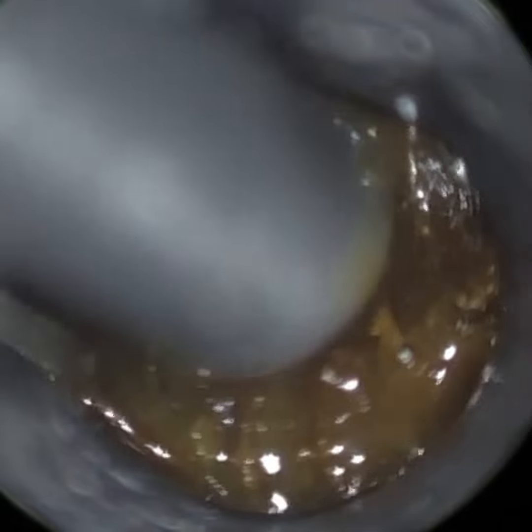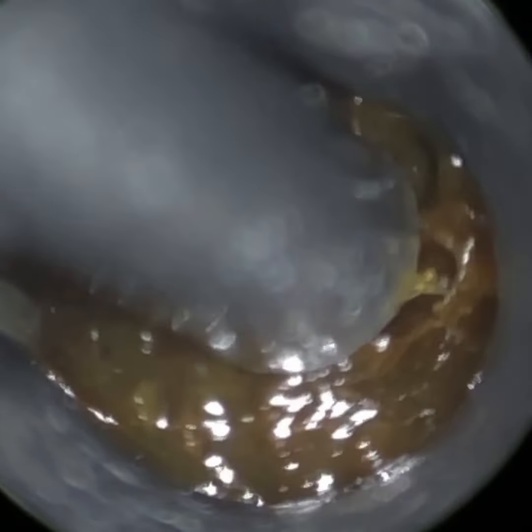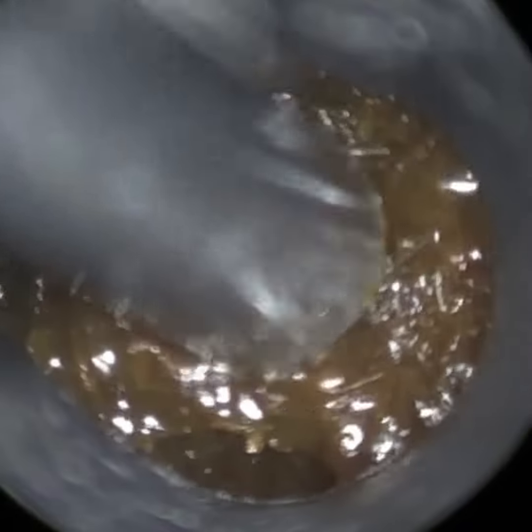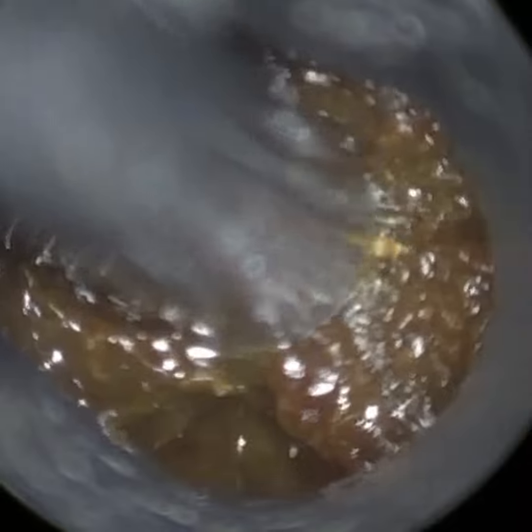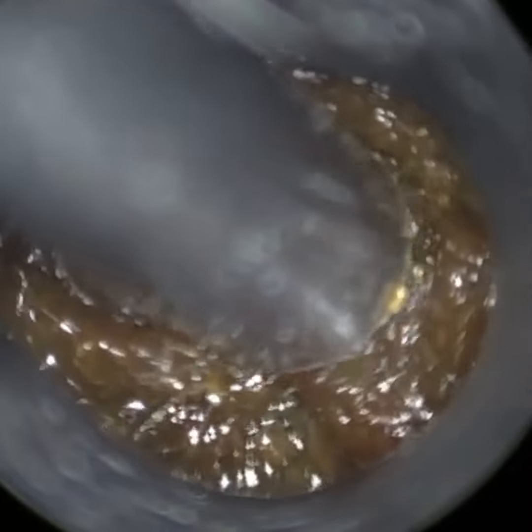We've had a client attend with bilateral, fully occluding, really dense earwax — quite a thick, dense consistency. Very early on I instilled some olive oil spray and I'm actually suctioning this whilst the spray is in situ.